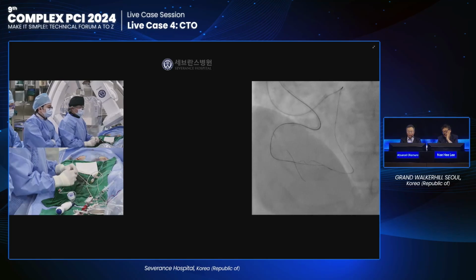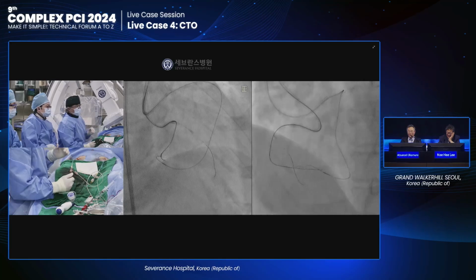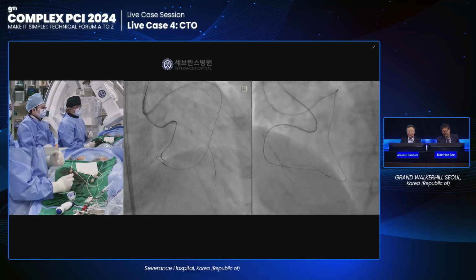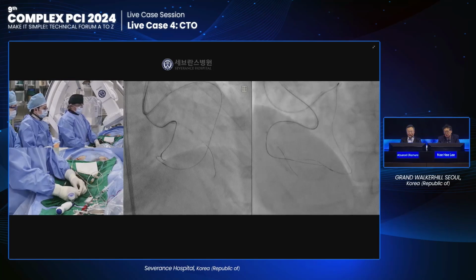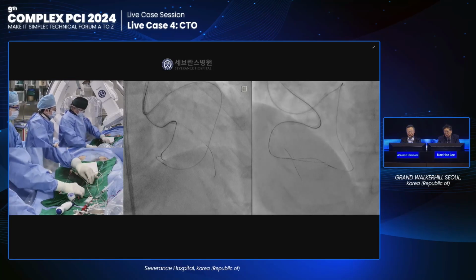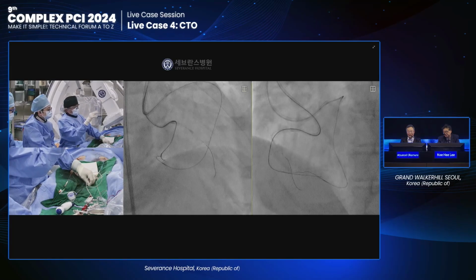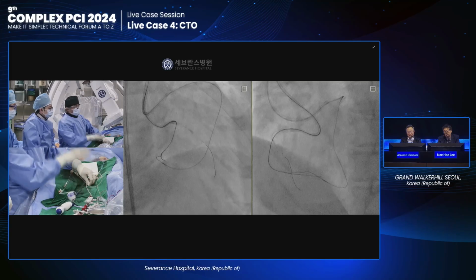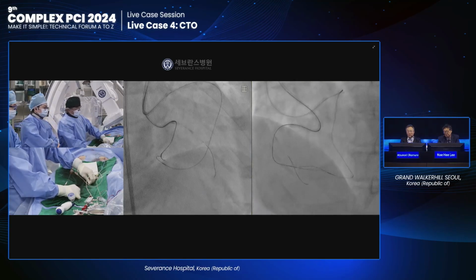In my opinion, what do you think? Yeah, so more proximal. Yeah, exit. Right. The gap is very different, right? So previously I felt some resistance point, which is some calcification point. After that, the wires go out into the false lumen portion.